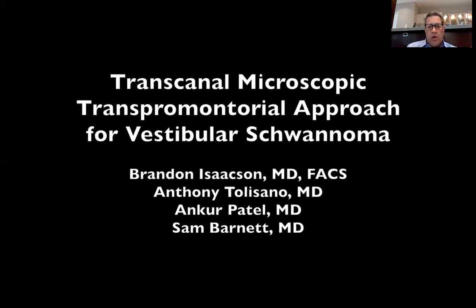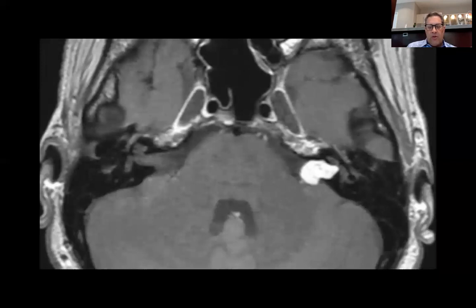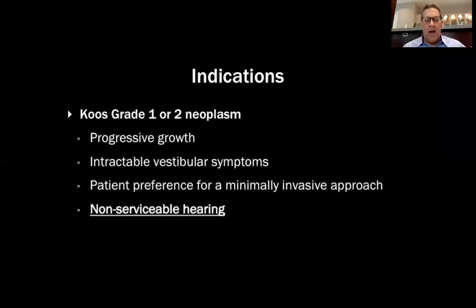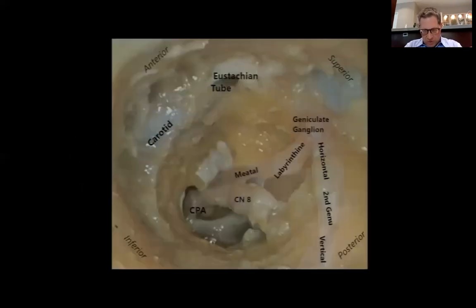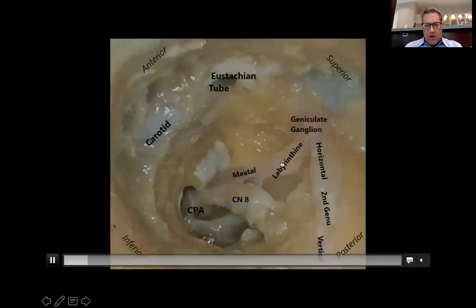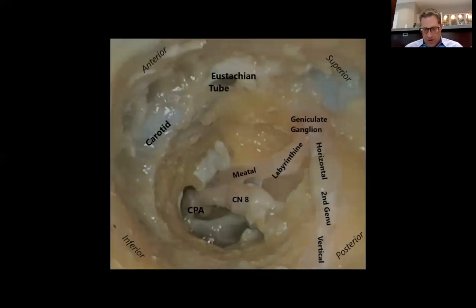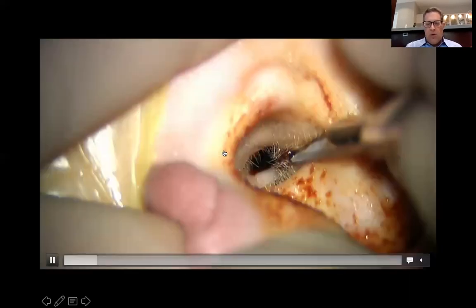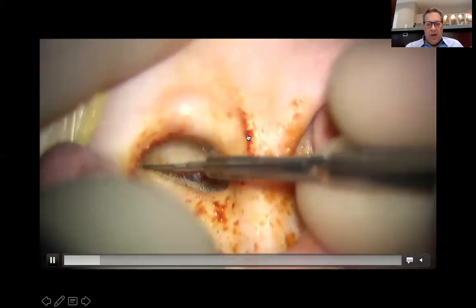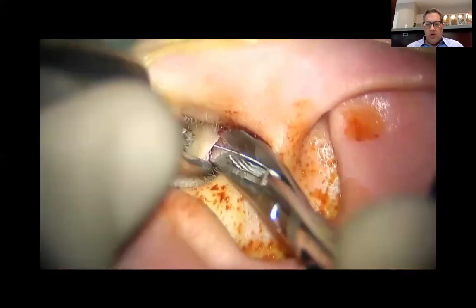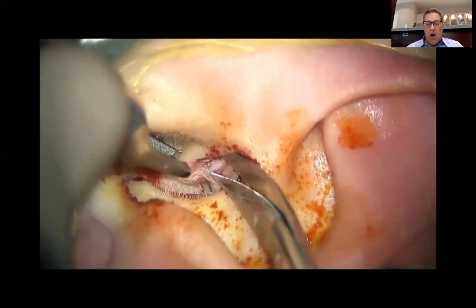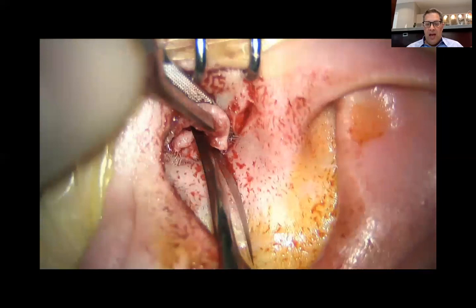This next case involved a slightly larger tumor. Around my second or third case doing these, I realized that endoscopic approach was very difficult for removing the amount of bone needed with one hand while using irrigation and suction simultaneously. So we switched over to using a microscope for these cases. This tumor did have some CPA extension, making it more difficult. The same anatomy slide inverted now shows a left ear — you can see the carotid artery. Here is the modified Rambo flap on a left ear: we make two incisions at 6 and 12 o'clock and transect the canal skin, starting by dissecting the tragal skin off the tragus.